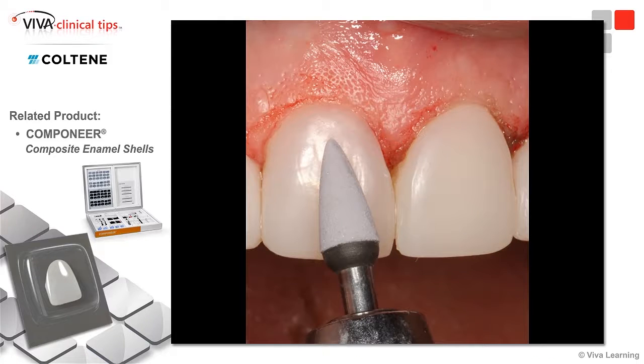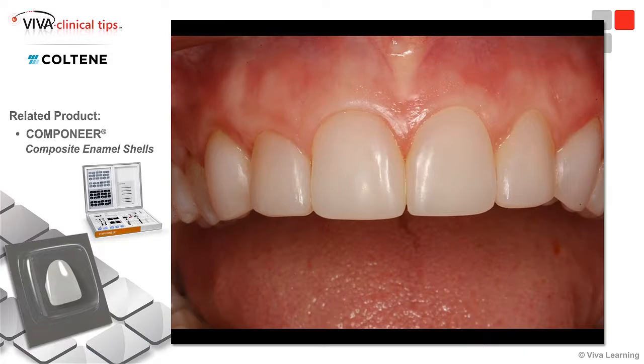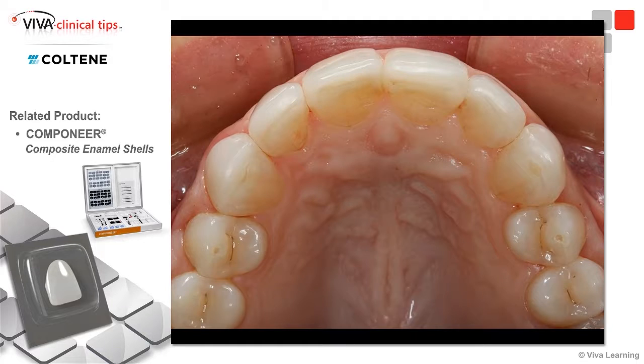And these are polishing points, and this beautiful little brush that we use to finalize it, and you get this really nice look. So 6 COMPONEERs placed on these teeth, and that's the way they were actually intended to be placed, direct. Those are direct composite veneers, and you can see the marginal adaptation here is just excellent with these materials.